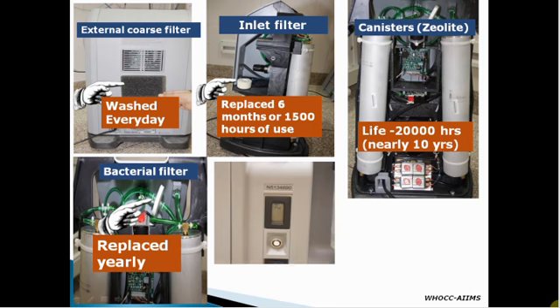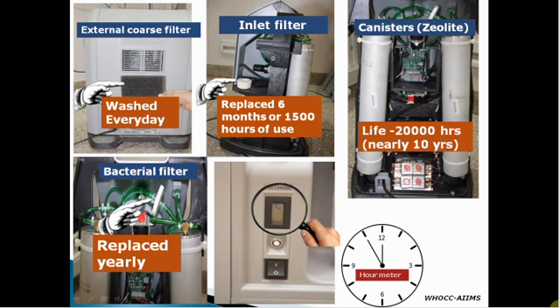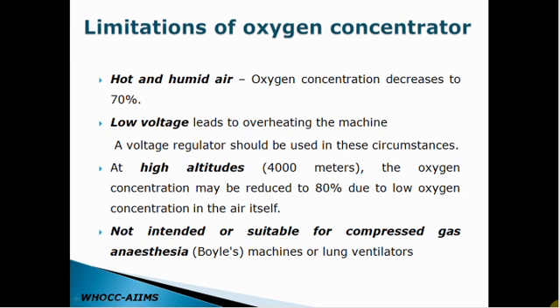Every concentrator has an hour meter. The working hours should be written down in the service report. The concentrator may work 24 hours a day, every day, as long as the daily maintenance procedures are carried out.